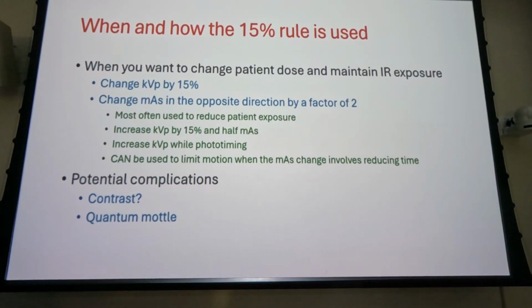In rare cases, we even have to do a KUB on a pregnant patient, or an AP of the L spine when the patient's been in a wreck. The baby is secondary in the wreck, right? We've got to make sure mom's okay before we can worry about the baby. You might have to shoot an AP L spine or a KUB on a patient who's been in a car wreck and she's pregnant, big, obviously pregnant. Might have to do it.